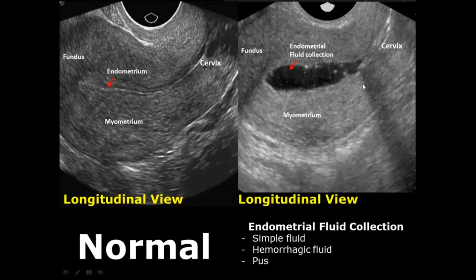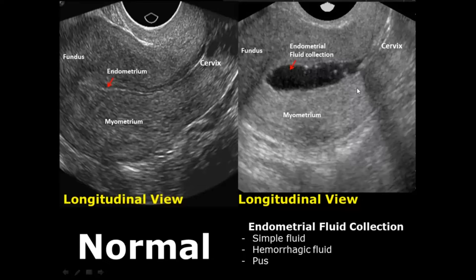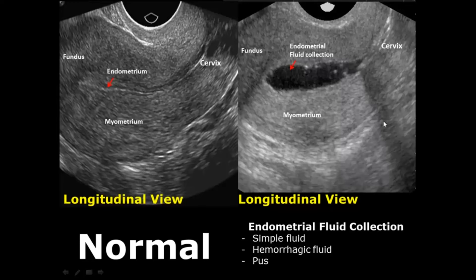Endometrial fluid collections can result from a variety of causes and have three different types of fluids. Simple fluid will be anechoic, completely black in appearance. Hemorrhagic fluid can have internal echoes due to clotted blood and blood products. Pus collection due to infections will also give internal echoes and septations, giving it a heterogeneous fluid collection.